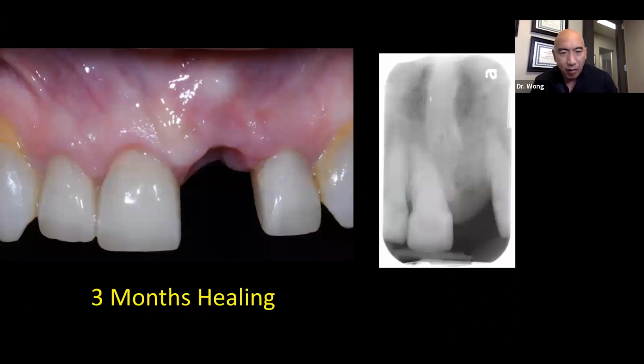For a bridge, you want an ovate pontic that goes 3 millimeters subgingival. But for an implant, you don't want it touching the tissue. So here the flipper was a little bit too aggressive. You can also see it was a little aggressive on the distal papilla too, kind of pushed on it. So that's what affects the soft tissue in this situation.